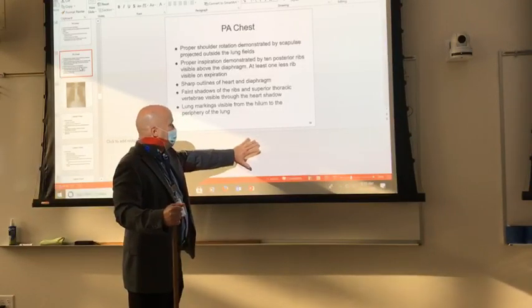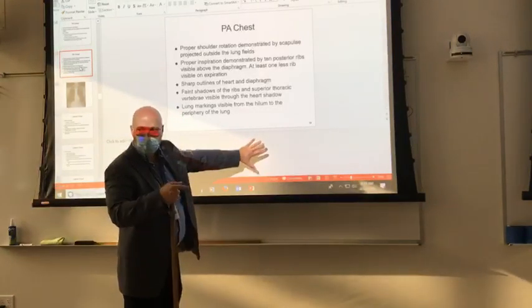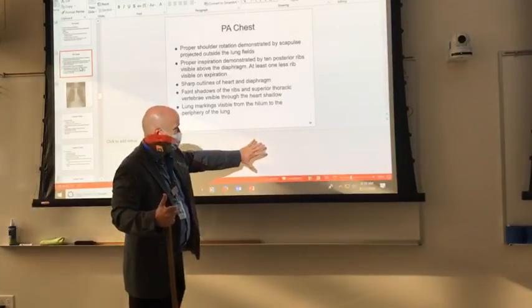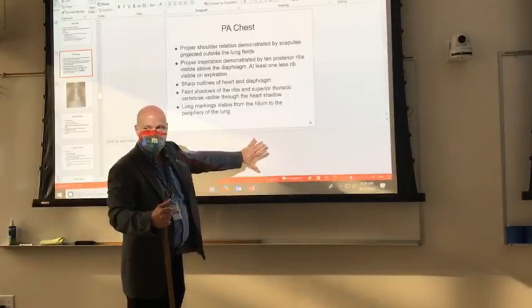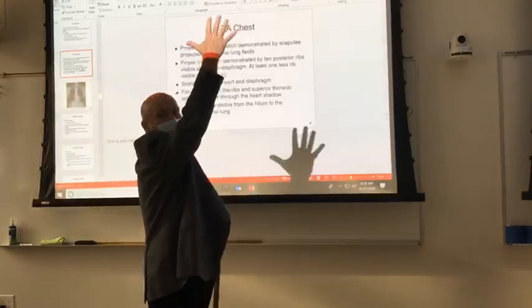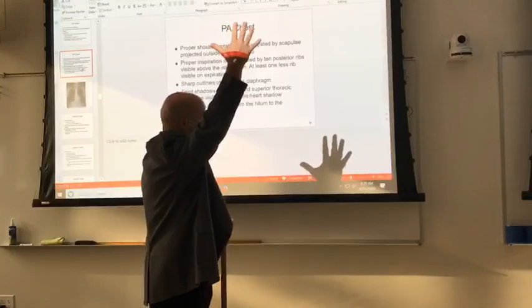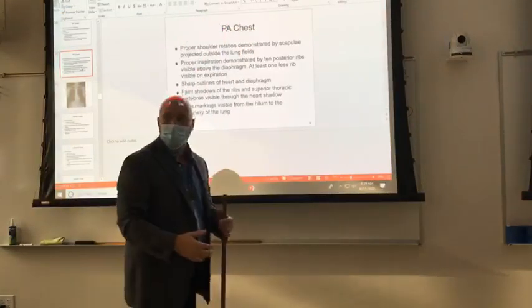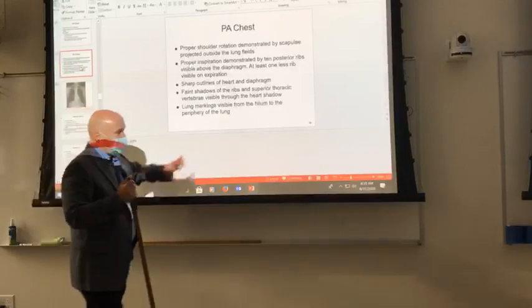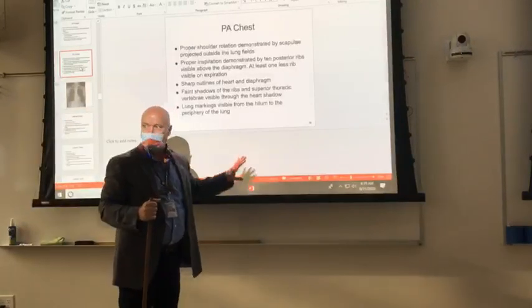Again, the video didn't work last Monday, so just to give y'all this visual: if I put my hand really close to this board, the shadow, the outline of my hand, is about the same size as my hand, and it's real sharp, right? But if I back it way up here, what happens? It gets real fuzzy, right? It gets real fuzzy and it gets real big. So we want to put our anatomy as close to the image receptor as possible, okay?